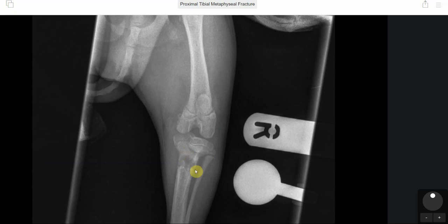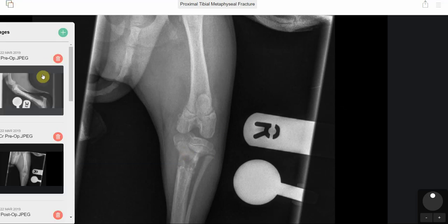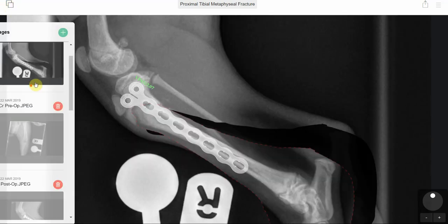In terms of the caudocranial view, the fracture could be seen down here. So we had our plan of what we wanted to do, and then we just had to put it into action.